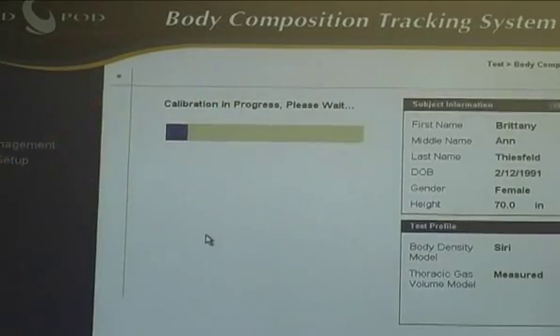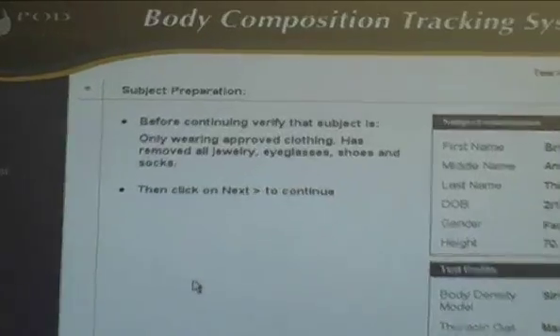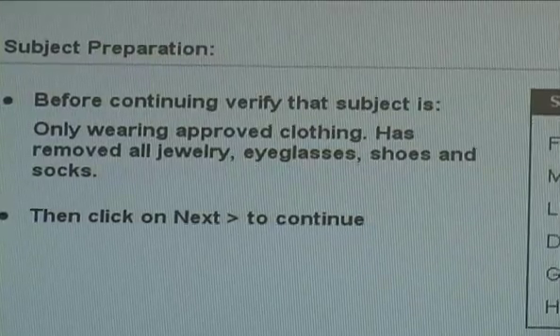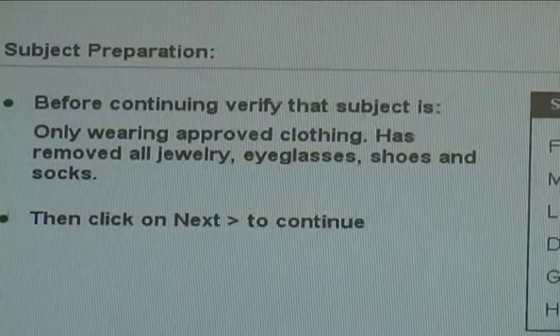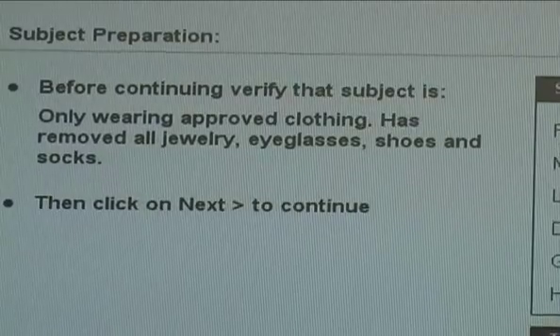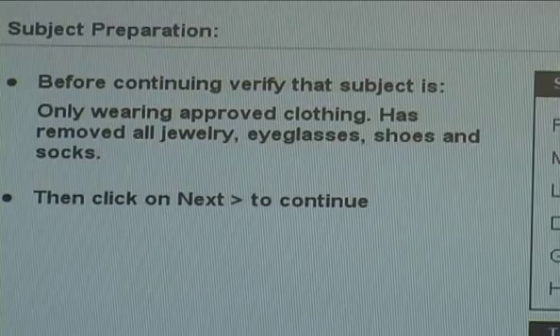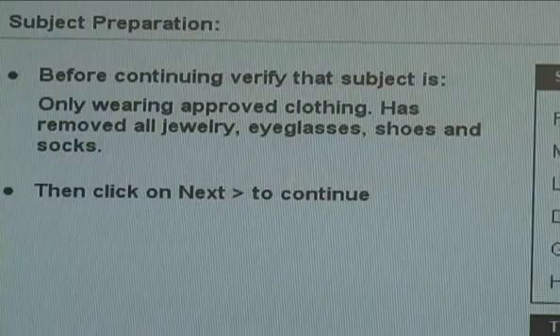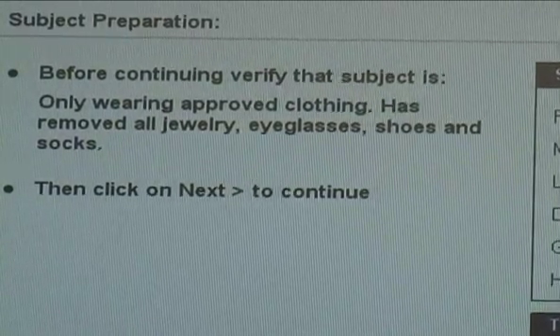And when this is going on, you can actually weigh the subject. So this is a reminder. I will go into this a little later, but you want to make sure that the individual isn't wearing jewelry, excessive jewelry, eyeglasses. If you know who Flavor Flav is, he has the big clock. I don't have any clocks or anything. If it's like a wedding ring somebody has never gotten off their finger since they've been married, that's fine. We want consistency. So you know that when you test Judy or Sam the next time, they're going to still have this wedding ring on. But for consistency purposes, no excess stuff.